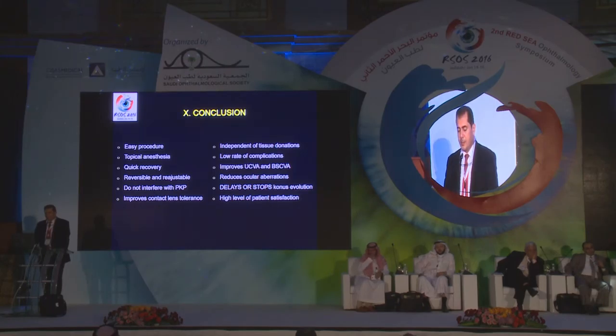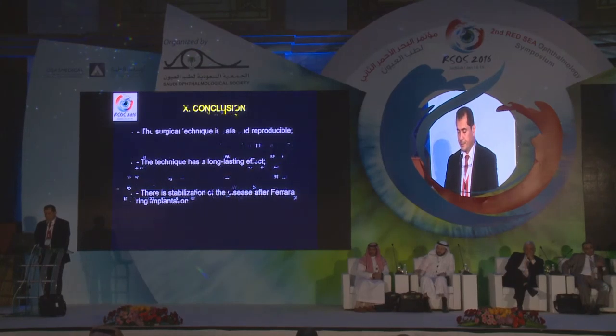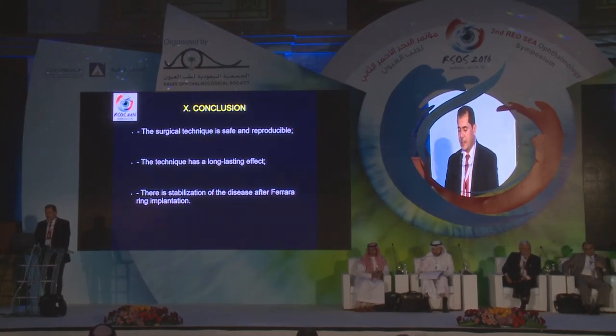Conclusion: easy procedure, topical anesthesia, quick recovery, reversible and readjustable, does not interfere with PKP, improves contact lens tolerance, independent of tissue donations, low rate of complications, improves uncorrected visual acuity and best corrected visual acuity, reduces ocular aberrations, delays or stops the cone's evolution, high level of patient satisfaction. The surgical technique is safe and reproducible. The technique has a long-lasting effect. There is stabilization of the disease after Ferrara ring implantation.